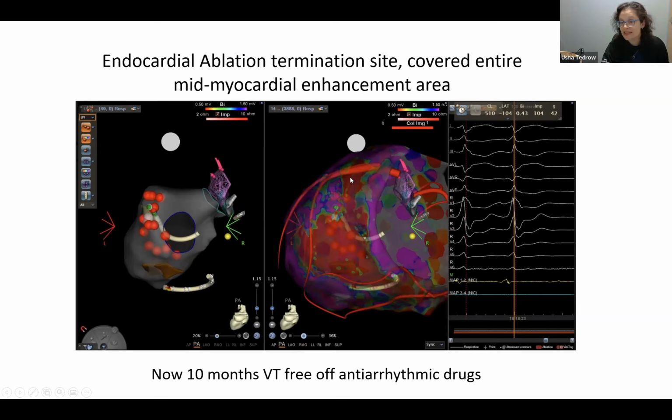It is really amazing because when we remapped the epicardium after we were done ablating, the epicardial scar was much, much bigger, even without delivering epicardial lesions. We only delivered endocardial lesions. And this gets back to Dr. Bourier, who I think was making the point that maybe we can reach some of the epicardial substrate or block some of the mid-myocardial substrate and get transmural effects from the endocardium. It's really interesting, and pretty clearly, with a normal ventricle, you could never affect the voltage map in this way.